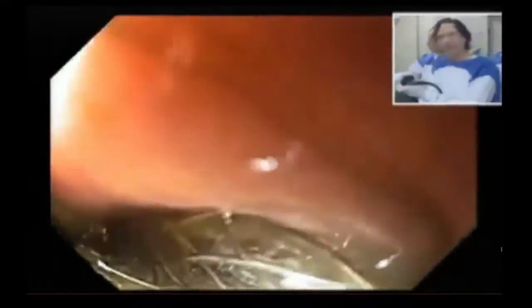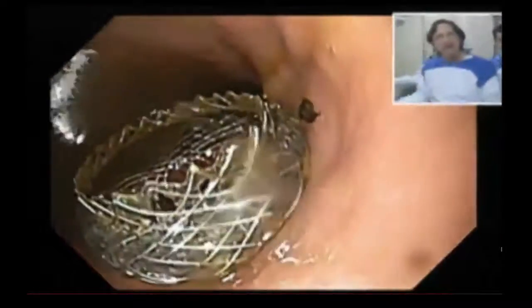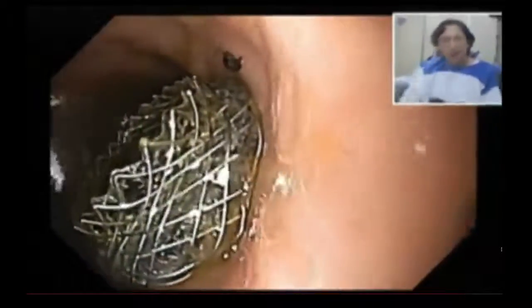Okay. That's important. There's another question from the internet about the follow-up. Follow-up, yes. 1 month CT scan. Okay. And then if the cyst is gone, then remove the stent, and you'll have a nice mature tract that will gradually close down. Thank you. Yes.